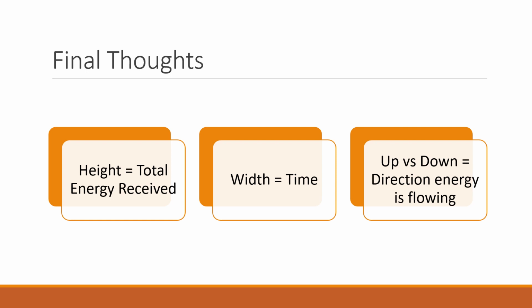And that is also applicable when we're talking about things like ST elevation, ST depression, and many, many other things.